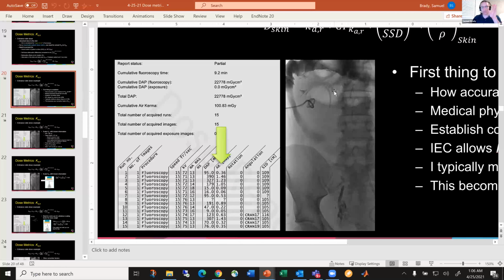So when you get that software, you want to send this report that you see on my screen. This report, the dose report, goes to PACS. I would highly recommend you archive that in some place like PACS or wherever you are. And then the structured dose report would go to your dose reporting software. I thought we should send the last page of the dose report to our archive for every patient, because we put the radiation dose to the patient. That is a must-do.